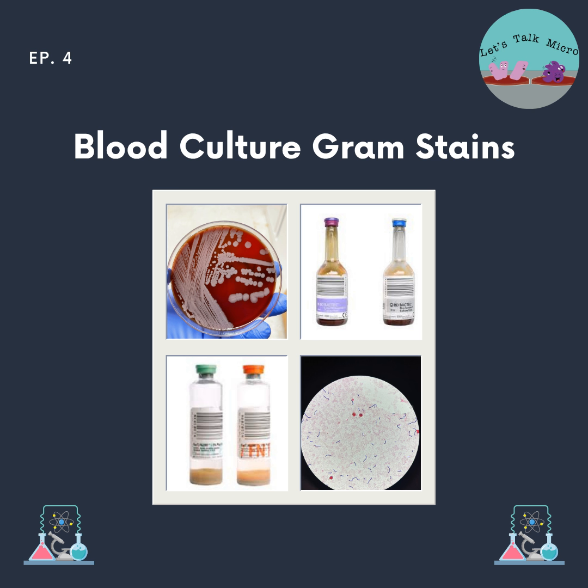Another difference is that you do not quantitate. So you just report the organism, gram positive cocci, like I said, gram negative rods, with the arrangement if you have it. But you do not say 1 plus, 2 plus, 3 plus. Not for blood cultures. Also keep in mind that if you are not sure about the gram result, meaning you're not sure if it's positive or negative, it is okay to report it as gram variable.